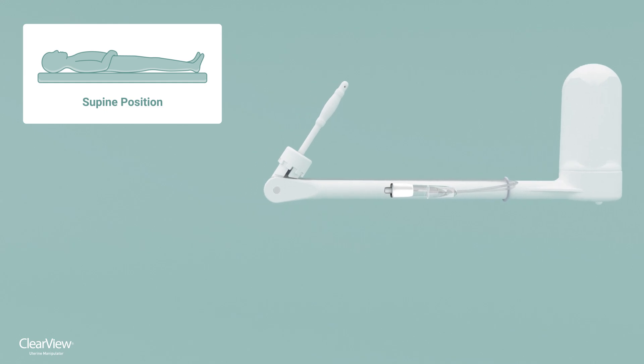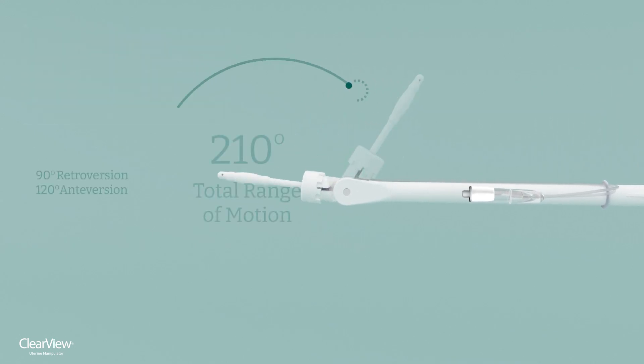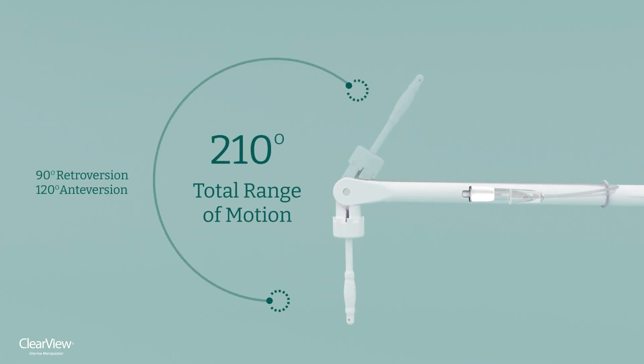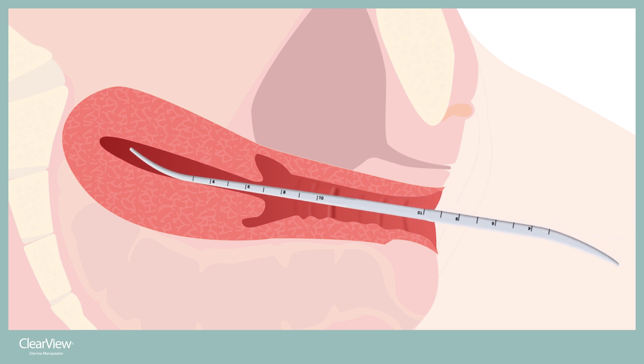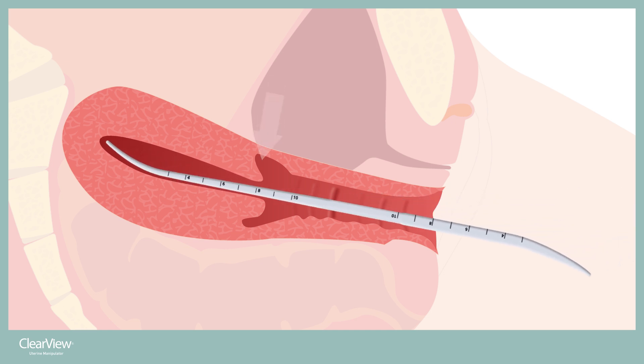ClearView boasts the greatest range of motion of any uterine manipulator, allowing 90 degrees retroversion to 120 degrees anteversion. This provides greater visibility and access to the posterior cul-de-sac and paravesical space, improving the safety of the procedure. When using the ClearView, the uterus is first sounded to determine its depth and direction.